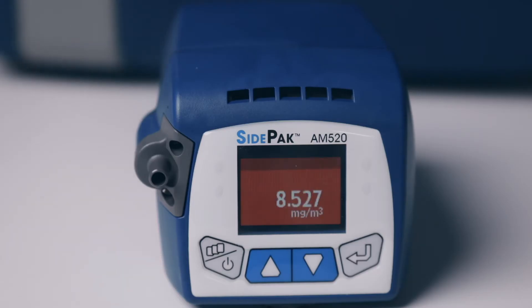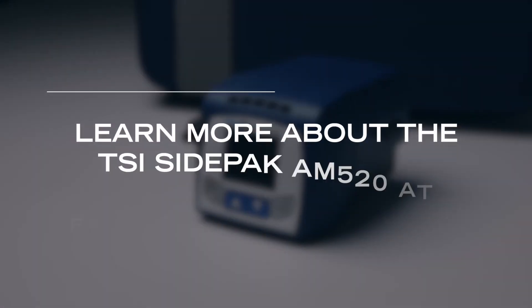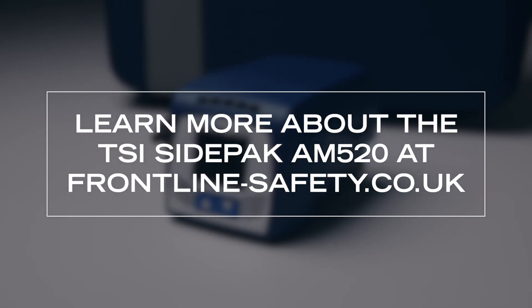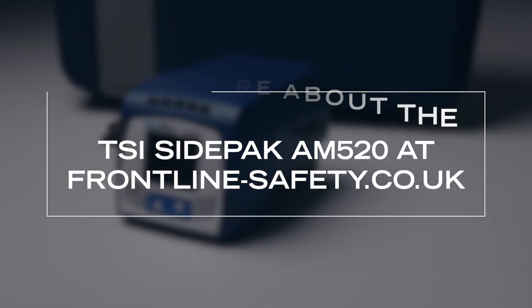If the level of particulates exceeds the set limits, the SidePak AM520 will alarm — the LEDs will flash and the audible alarm will sound. You can learn more about the TSI SidePak AM520 on the Frontline Safety website at frontline-safety.co.uk.